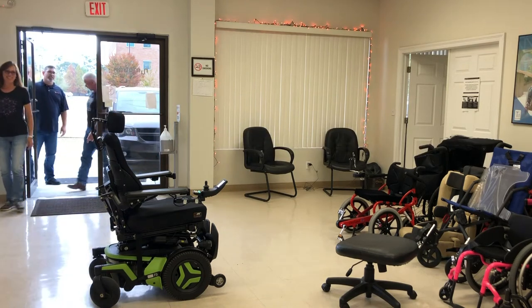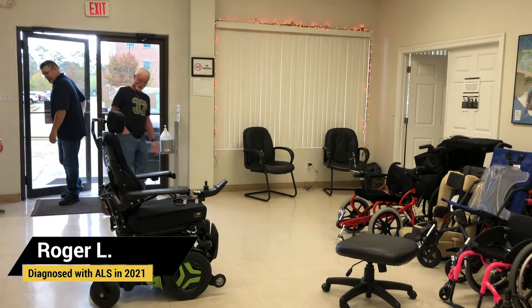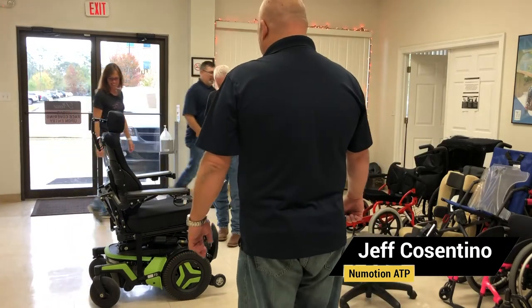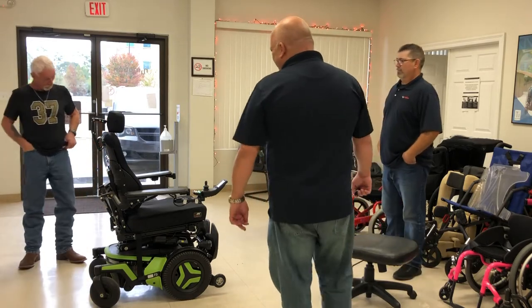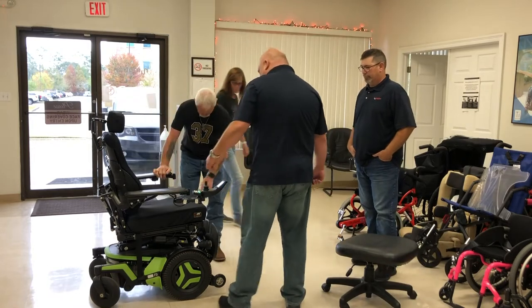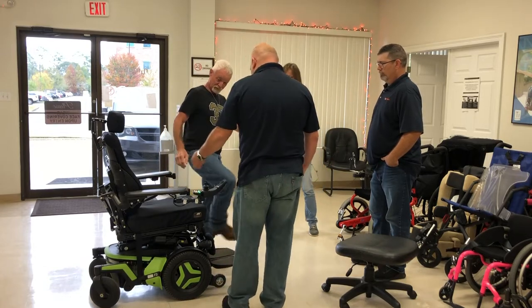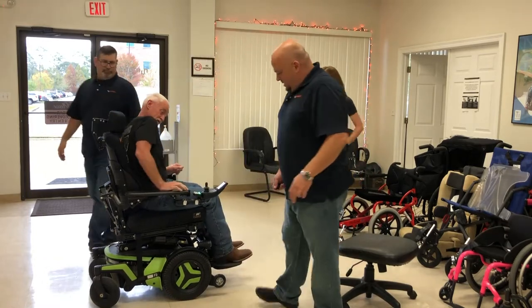Hey, how y'all doing? Long time no see! It's the green machine. So what do you think? Let's see if we adjusted it for you. Go ahead and get you in here — I'm gonna put this down. All right, there we go.